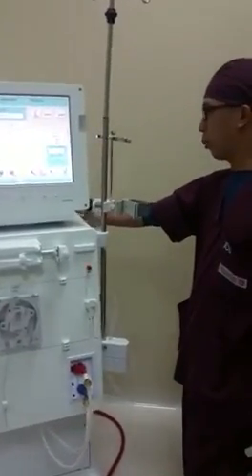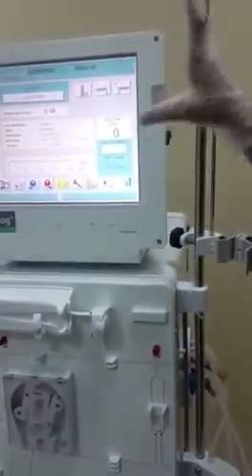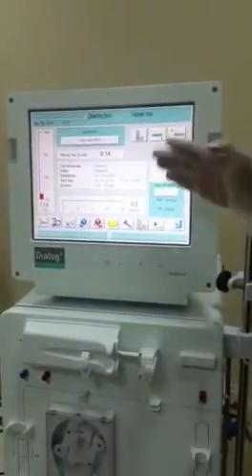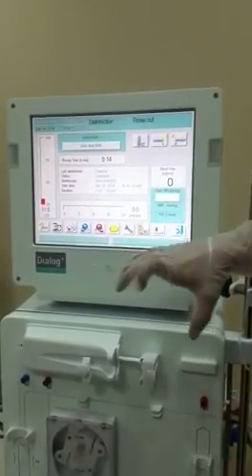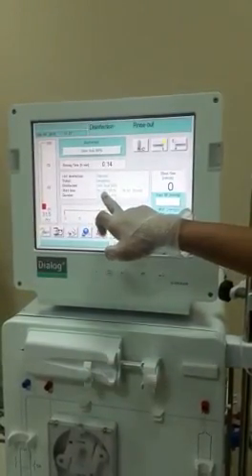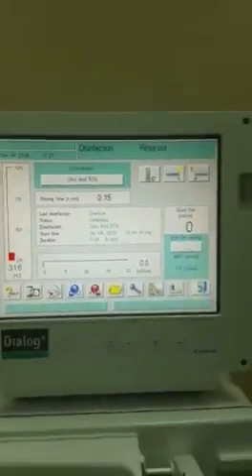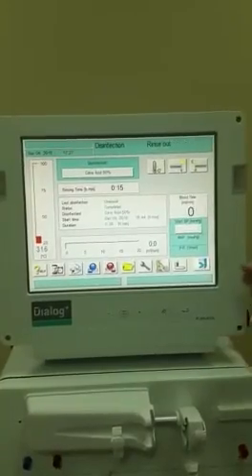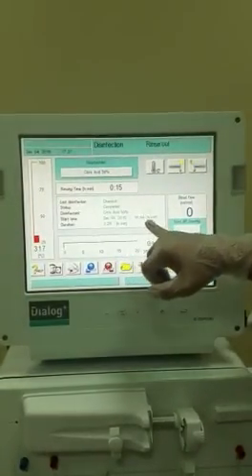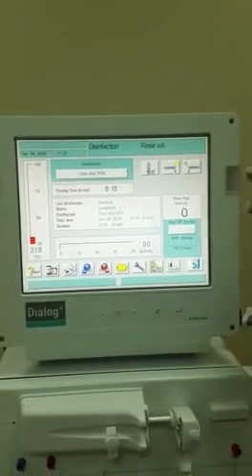After we press the on button on the side, the default screen that will appear shows that it was previously disinfected. You will check the date when it was last disinfected. Ideally, it should be disinfected before and after use. Because it was just disinfected 2 hours ago, we don't need to disinfect it anymore.